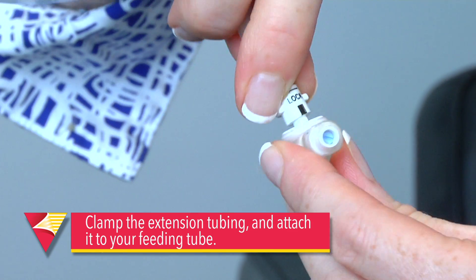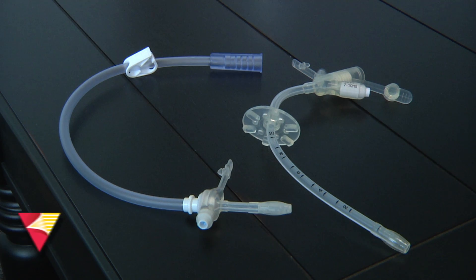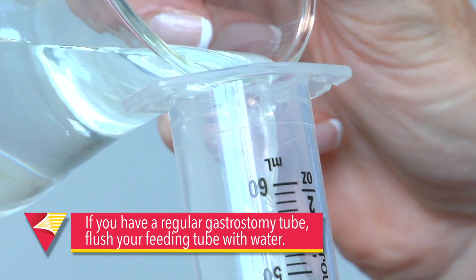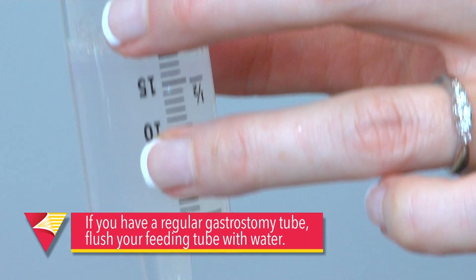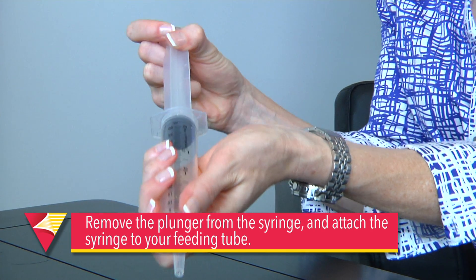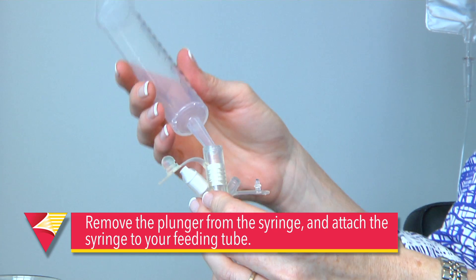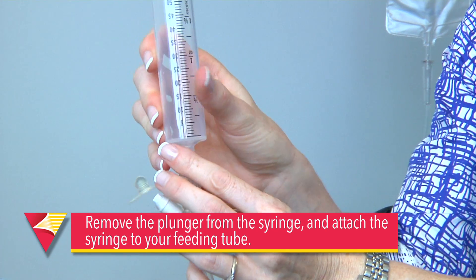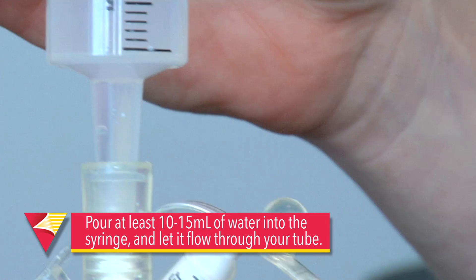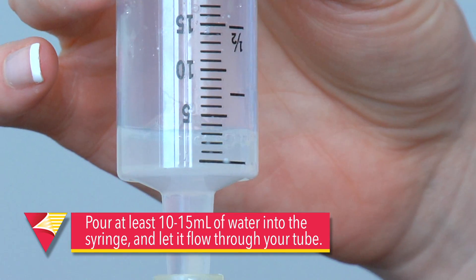Now you're ready to attach it to your feeding tube. If you have a regular gastrostomy tube, flush your tube with water. This will help to push anything through that might be stuck in the tube from your previous feeding. To flush your tube with water, remove the plunger from the syringe. Next, take your syringe and attach it to your feeding tube. Now you'll pour in 10 to 15 milliliters of water into the syringe and let it flow through your tube.